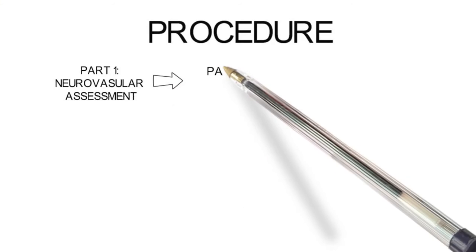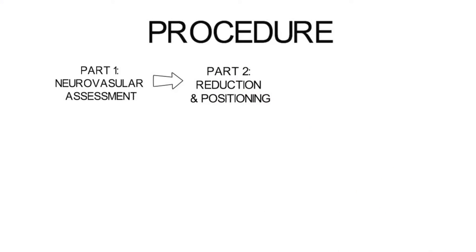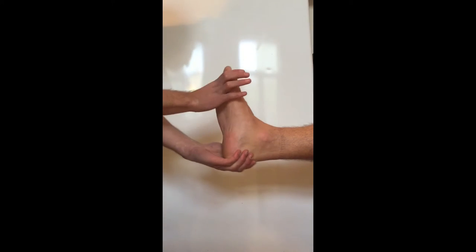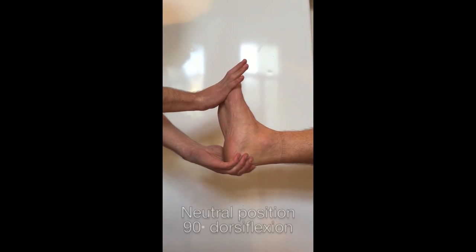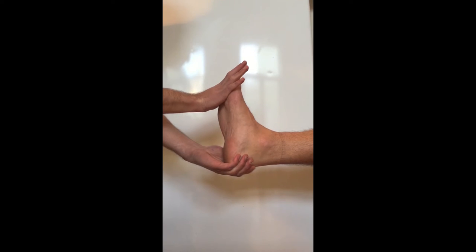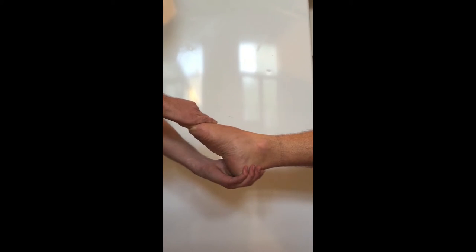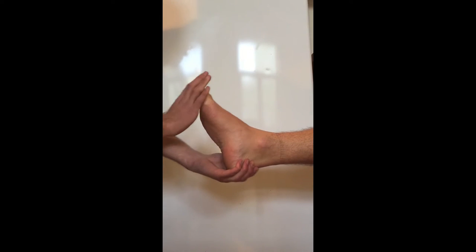The next step of the procedure includes reduction and positioning. The different reductions needed for each ankle fracture is beyond the scope of this tutorial and will be covered in subsequent videos. The usual position for the below knee POP includes moving the ankle into 90 degrees dorsiflexion, otherwise known as the neutral position. This is done to prevent the formation of an equinus deformity. However, one might opt to splint the ankle into plantar flexion — indications for this include a fracture of the talus and a rupture of the Achilles tendon. In this video, we will be demonstrating splinting the ankle in the neutral position.